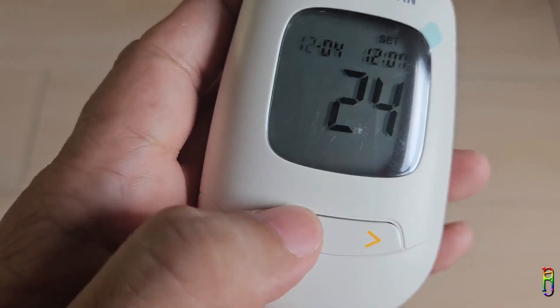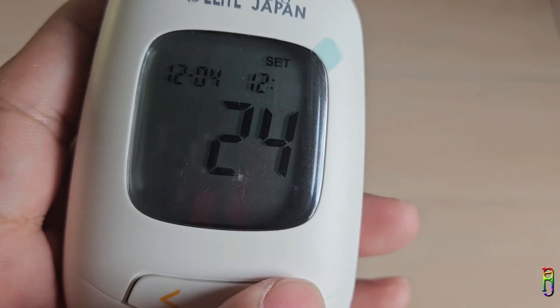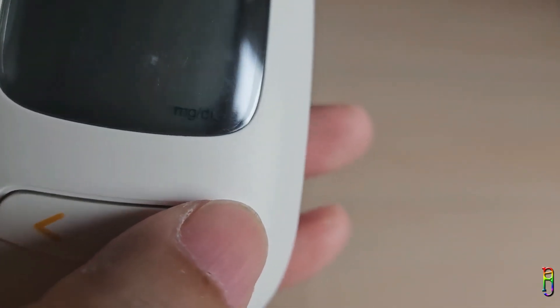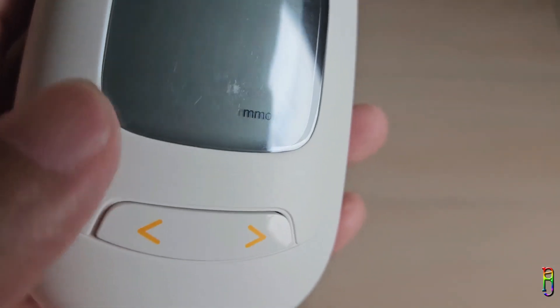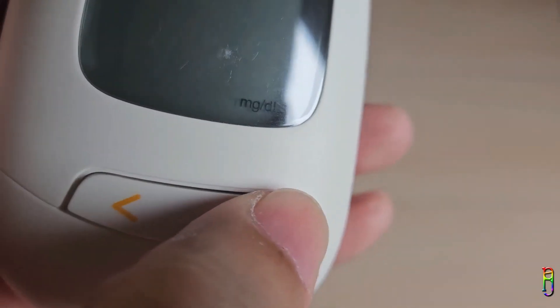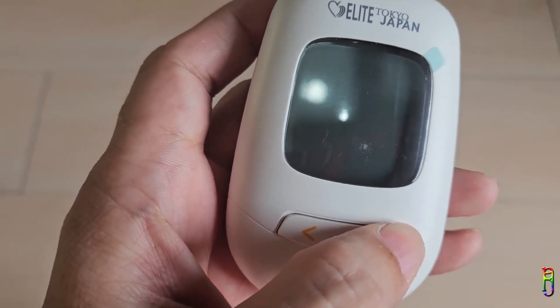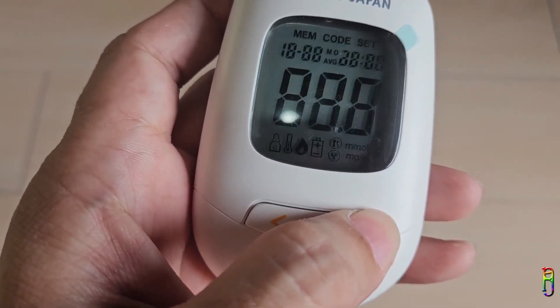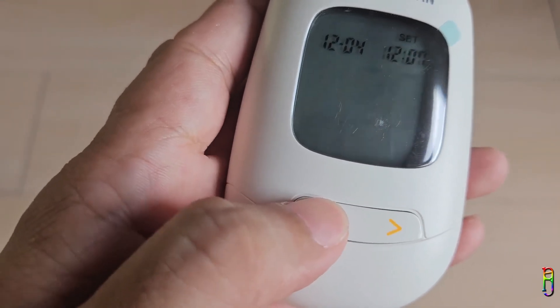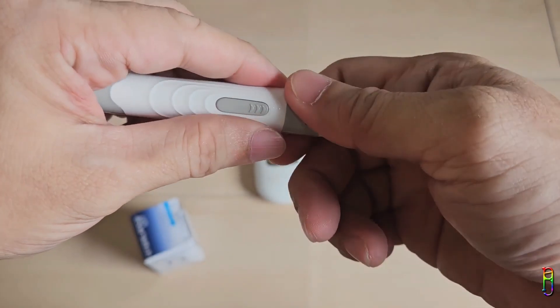Press the right button — the blinking number is now the month. Next is the day, then the hour, then the minutes. Press the right button again and at the bottom you can select your preferred unit: milligrams per deciliter or millimoles per liter. I'll select milligrams per deciliter, which is the most commonly used unit for blood sugar here in the Philippines. Press the right button again and the device will turn off automatically after a few seconds. If you want to go back to the setup screen, press and hold the right button for three seconds.